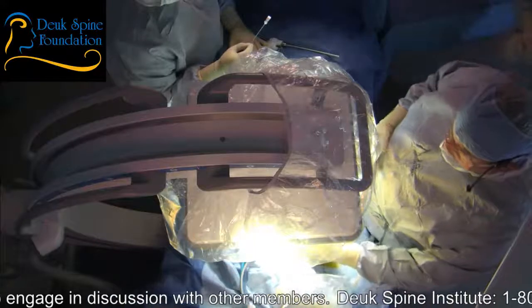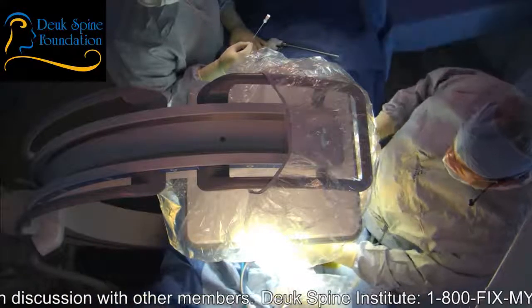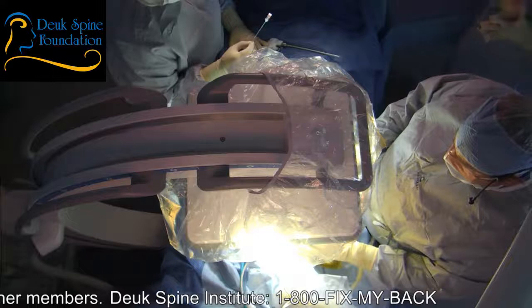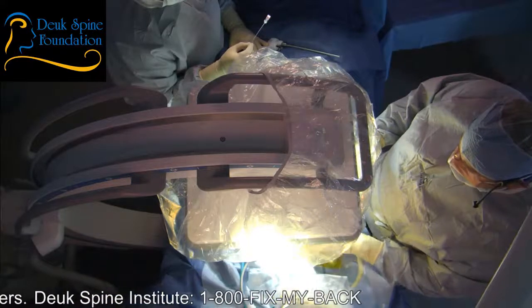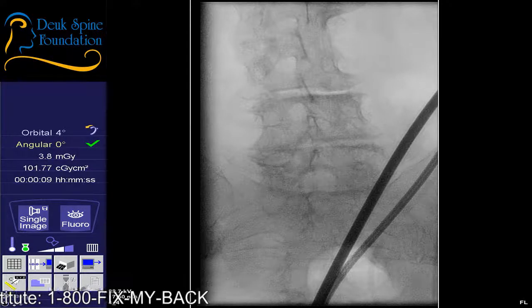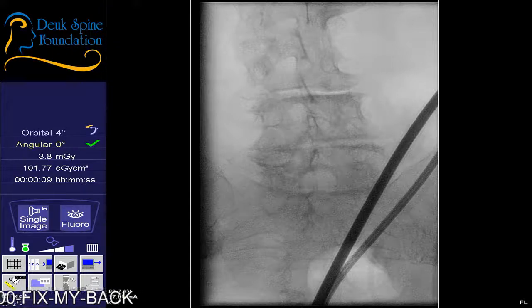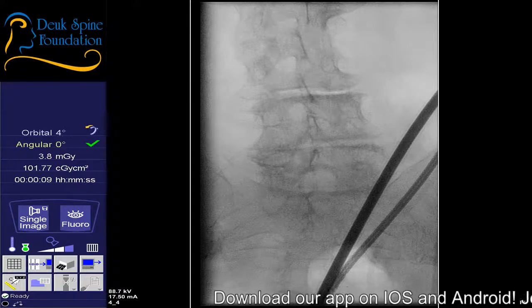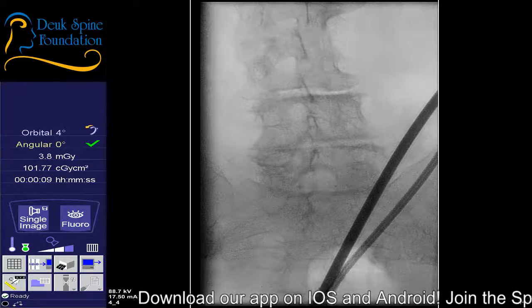All right. This is just my fingers pinching around a little bit, okay? All right. Now, are you able to see the x-ray view yet, Sean? We have an x-ray image up. Yes, I can. All right. Go ahead and show the audience the x-ray image. So you can see from this x-ray image, this is called an AP view, anterior posterior, front to back. You can see that we're looking at about L3 to S1. You can see there's a lot of twisting of the spine, collapsed degenerated discs, stenosis. Needle down, 6 cc's injected.